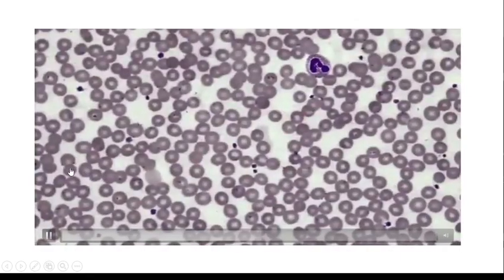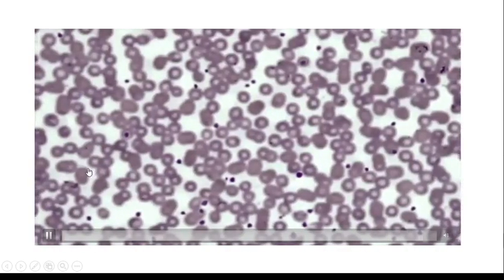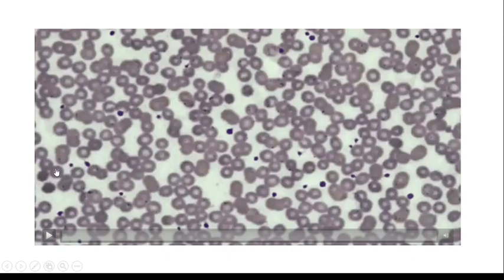Once the slide is focused, you have to scan the slide to locate the area which is going to be counted. We can see the cells. Over here, it is a little bit too thin. The other side of the area is a little bit overlapping with monolayer of the red cells.